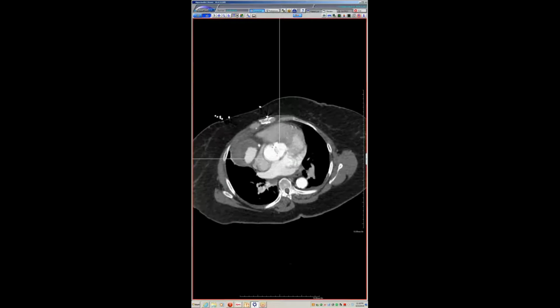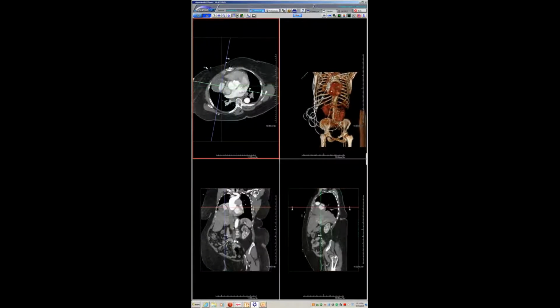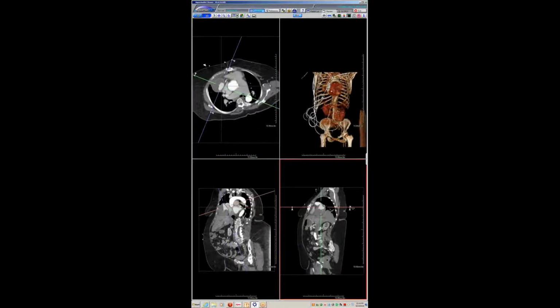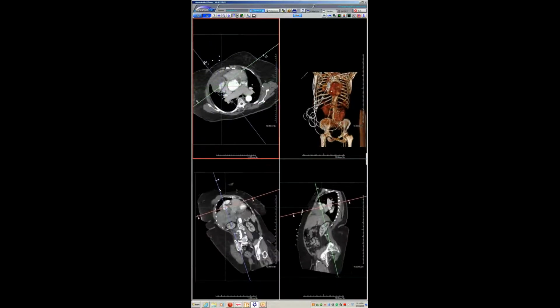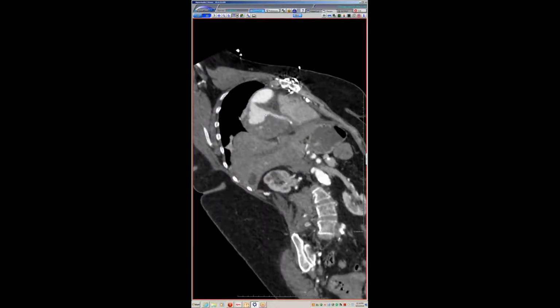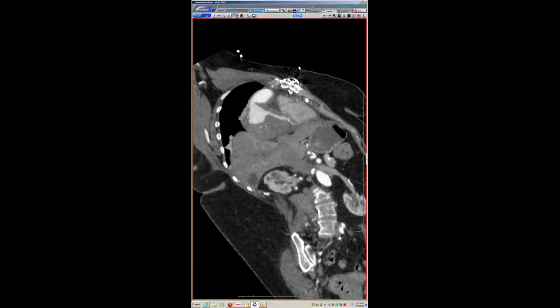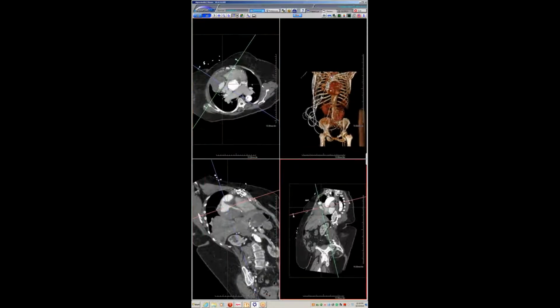Now you wonder, we were debating at what point can you get a saphenous vein graft pseudoaneurysm outside of the anastomosis? And I always call these aneurysms, but there were a couple areas where, here you can see it coming down. Here's the connection with the rest of the bypass graft aneurysm, which was still surprisingly patent. But then there are these other areas where you had contrast streaking out. I still think it's a contained aneurysm, but these usually occur 15, 20 years after surgery.